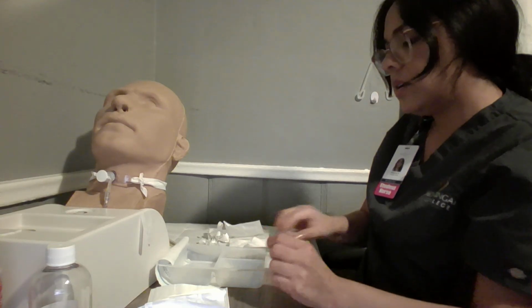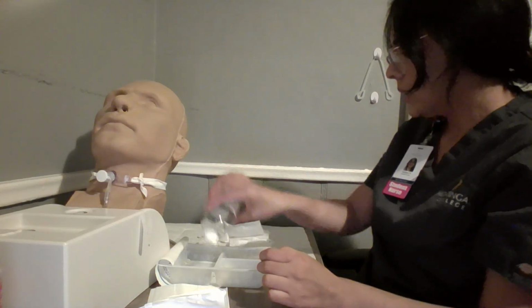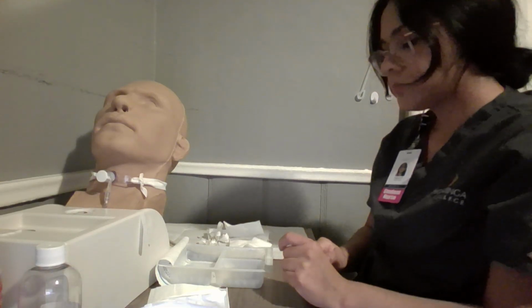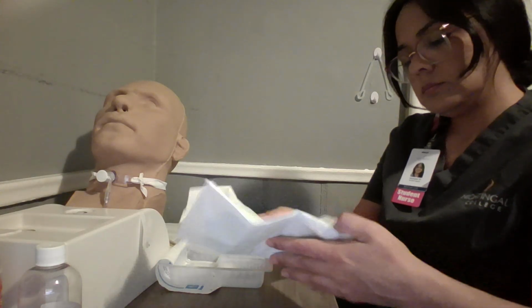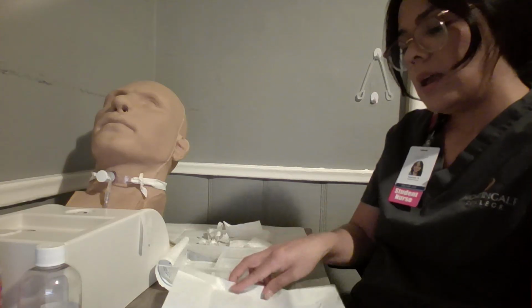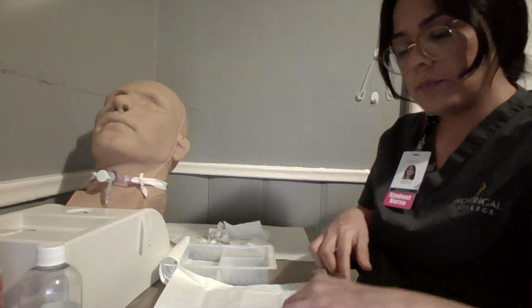I will then fill my basins with the cleaning solution here and the sterile normal saline into separate containers. I will now apply my sterile gloves. I want to make sure that I am only touching the 1-inch outer border here.